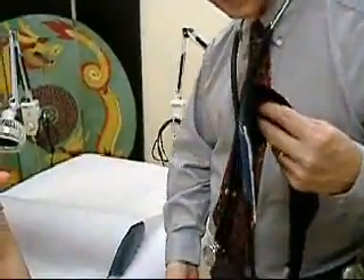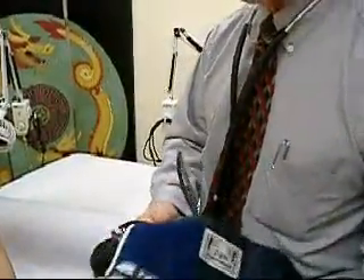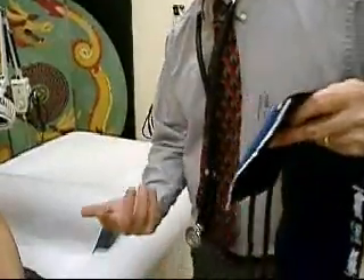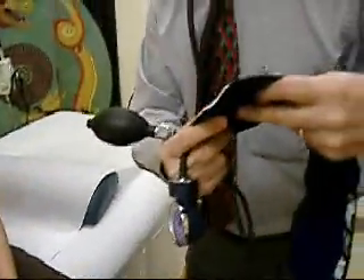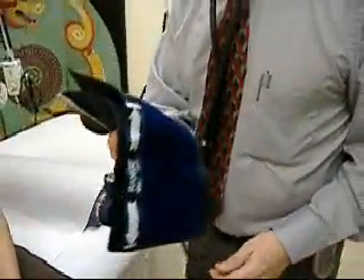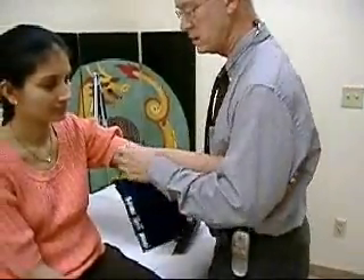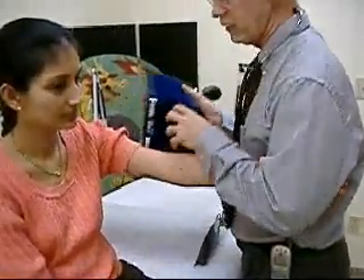Two goals when you're taking the blood pressure: you don't want to beat the patient up, and you don't want to startle them so you get an inaccurate blood pressure. So you'll take the cuff, go like so, and then hold and fold. That way you can control the tubing and get it on the person's arm without slapping them about the head and shoulders. When you take the arm, take it by the joint — that way you cause the least discomfort and have the most control.